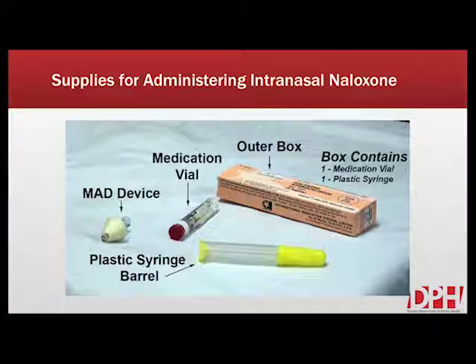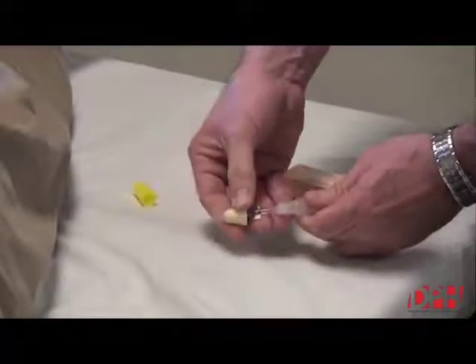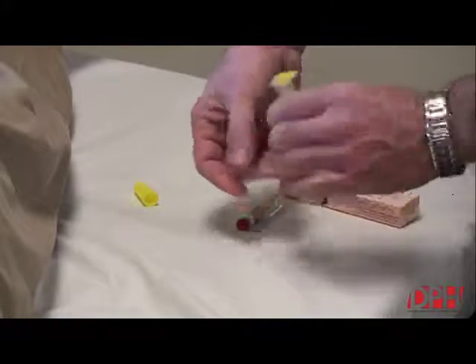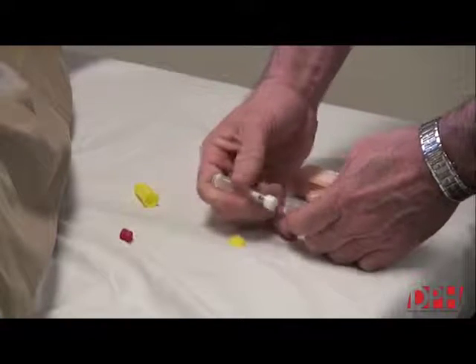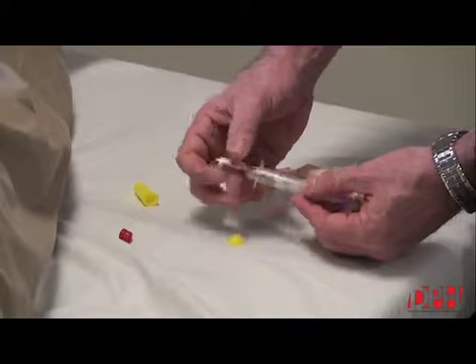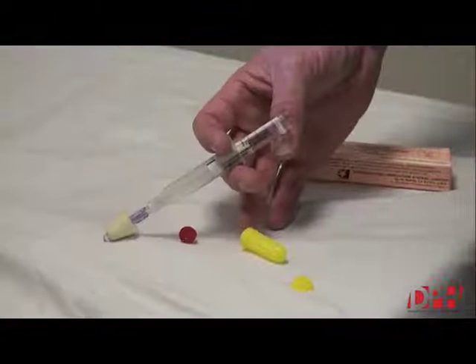Once you've gathered your equipment and removed it from its packaging, it's time to assemble your naloxone. Start by removing the large yellow cap from the end of the plastic syringe and then attach the MAD device using the wings. Then turn your syringe over, remove the other yellow cap, then remove the red cap from the naloxone tube. Insert the naloxone tube into the syringe and twist. You've now assembled your naloxone.